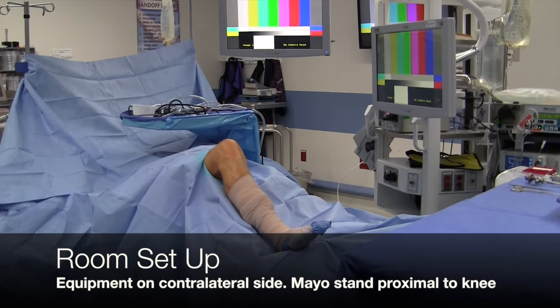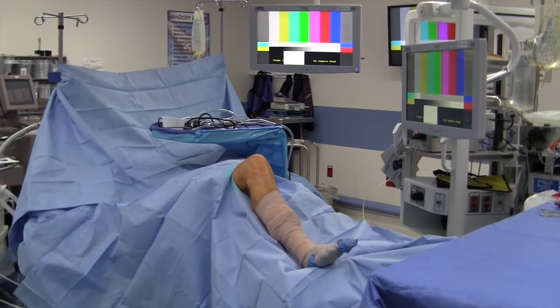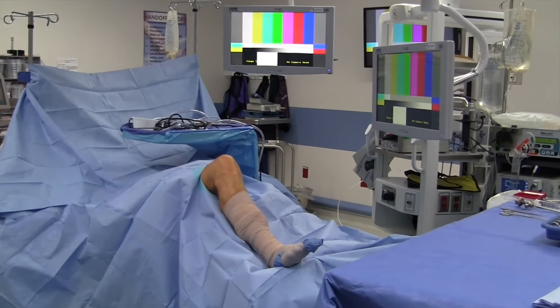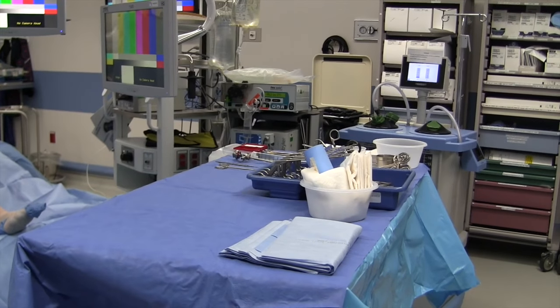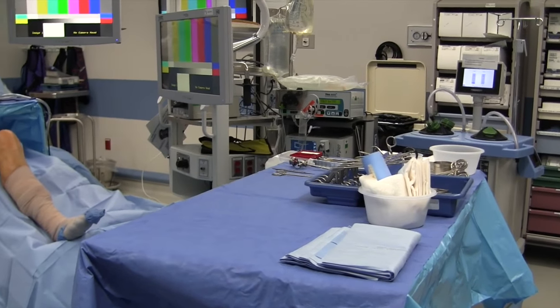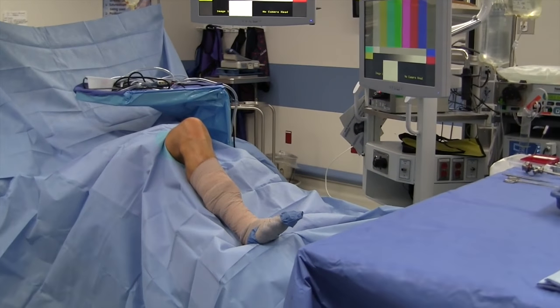Following initial positioning, an examination under anesthesia is performed. The leg is then prepared with chlorhexidine and draped with impervious drapes followed by an extremity drape. The leg is placed into an impervious stockinette and wrapped in coban. The back table and mayo stand are brought into place, and the arthroscopic tower and pump equipment and suction canister are placed on the contralateral side.